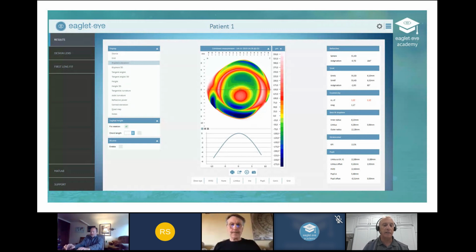So your first diagnostic lens is going to be exactly what you want, depending on which manufacturer, what the sag, which diameter you chose, all those things. So you put it on, and in this case, the right eye, it predicted a 4950. We ended up ultimately with a 4900 lens on that. The left, it predicted 5100, and we ended up with 5000.